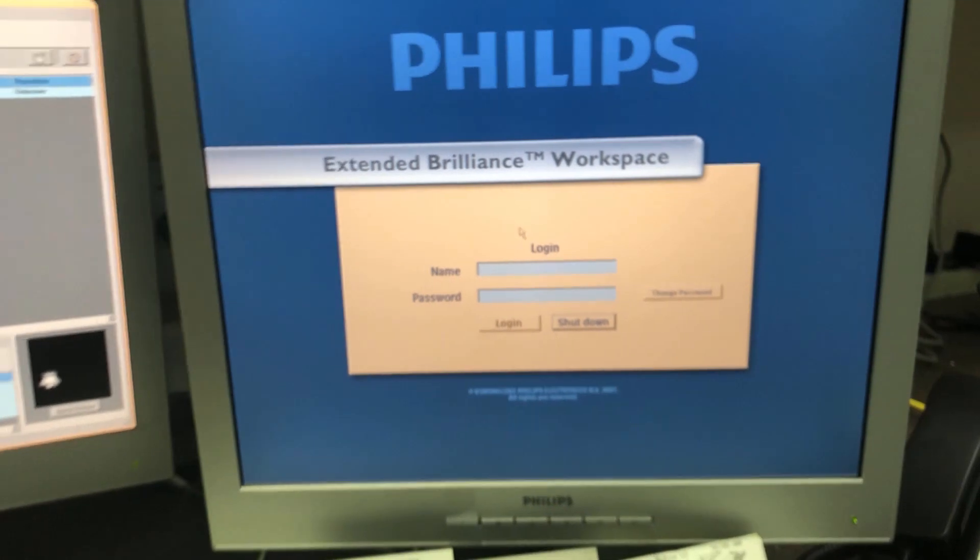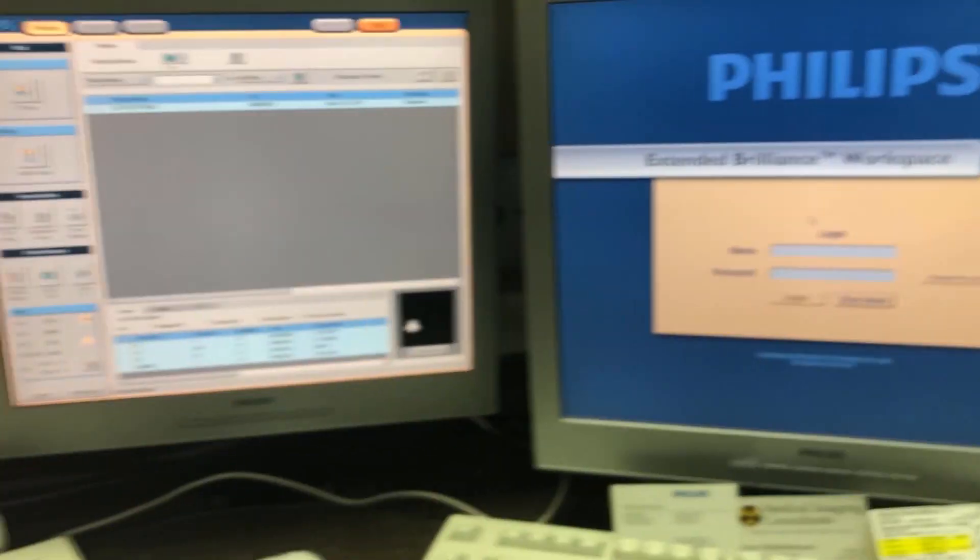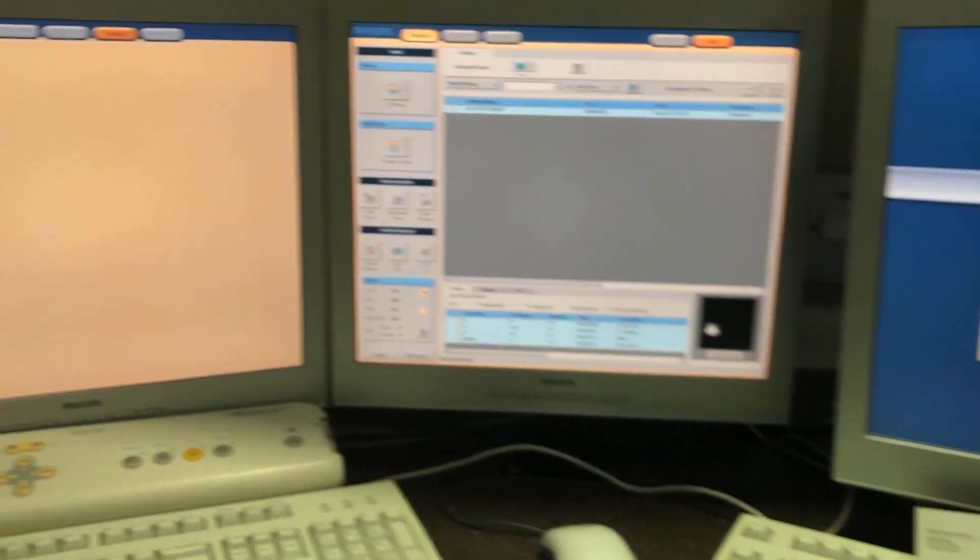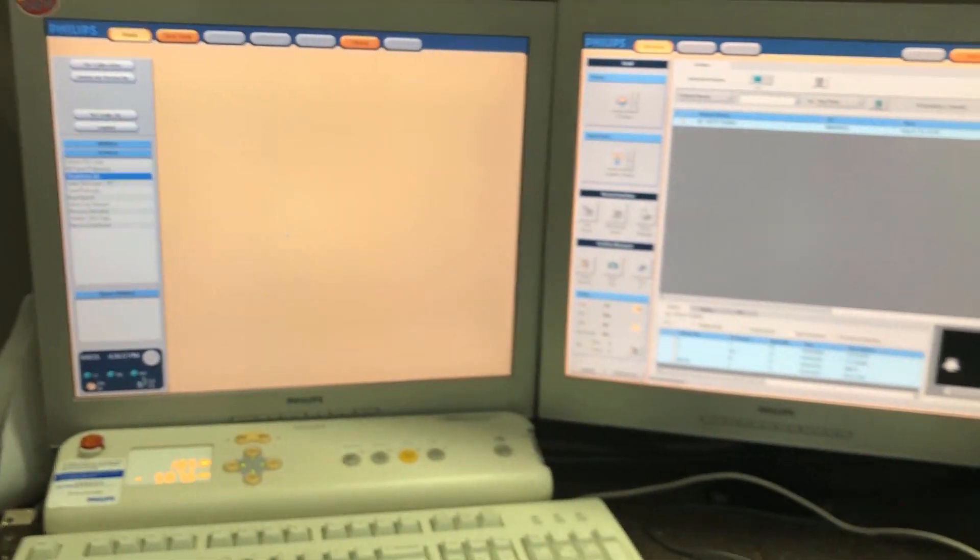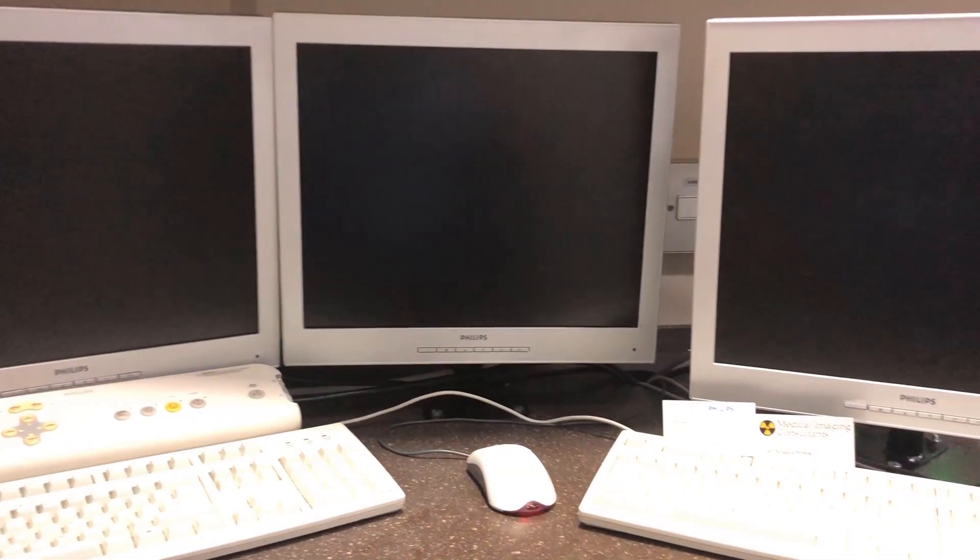Now we're going to wait for both computers to screens to go black. Okay, so all the screens are black now.